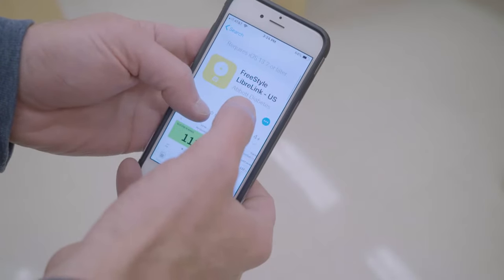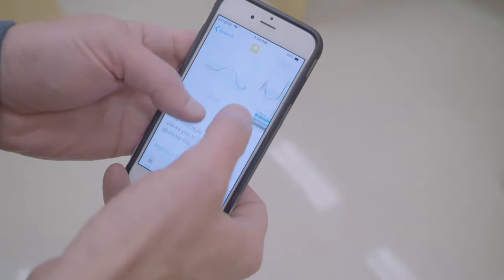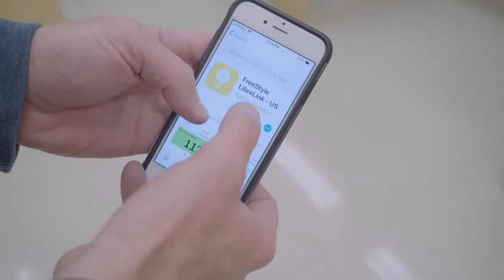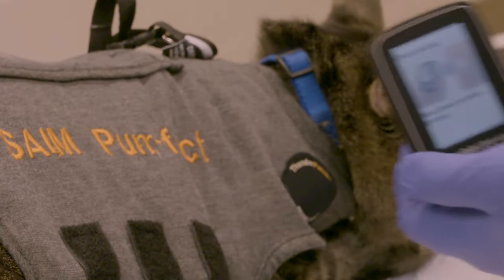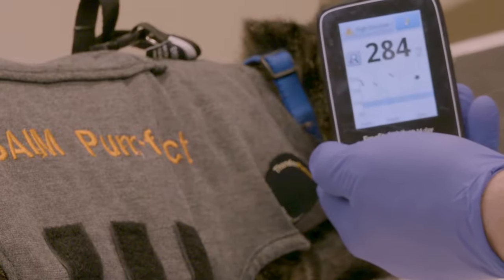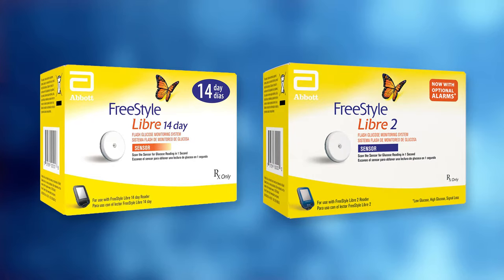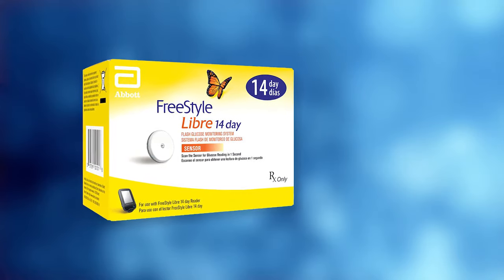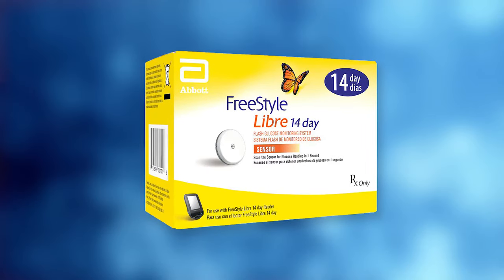Alternatively, you can download the Freestyle Libre app for Android or iPhone to monitor glucose and download the data to your phone. There are several advantages of using the dedicated reader rather than a personal phone, so that is what we recommend. Two different devices are available, the Libre 14-day device and the Freestyle Libre 2 device. The Freestyle Libre 14-day device is the one most frequently used in dogs and cats, and this is what we will demonstrate today in this video.